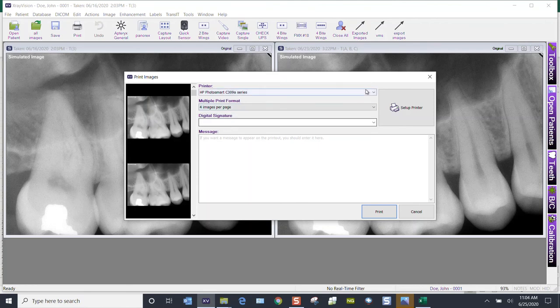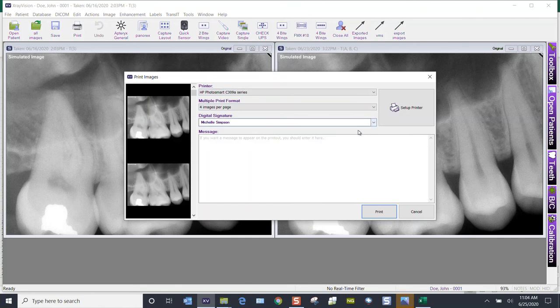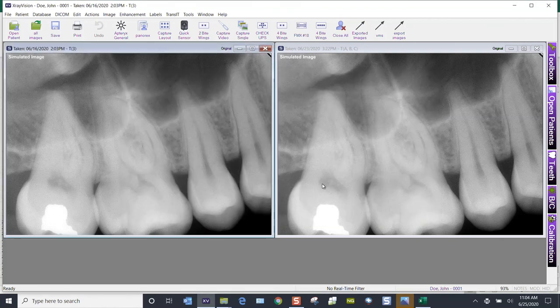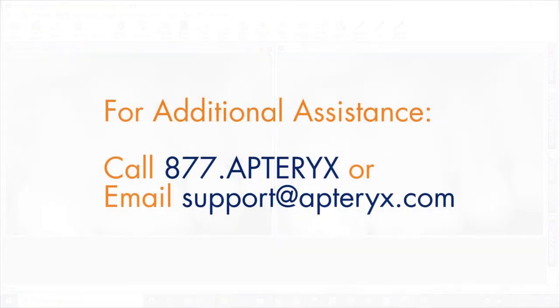Find your printer, and there's an option for a digital signature — if you've added one, you can type in a message and click Print. That's how we print multiple images in X-Ray Vision.